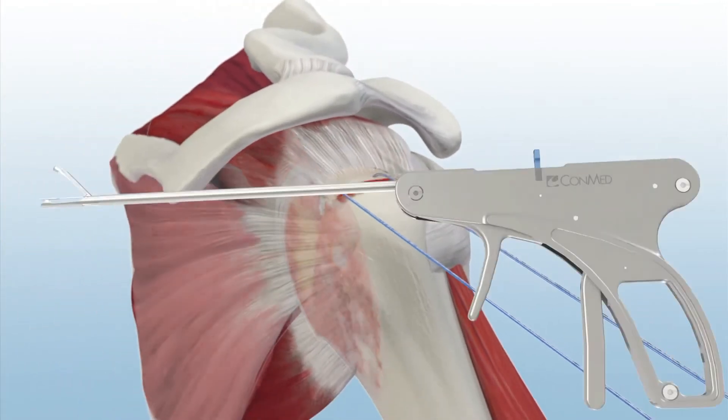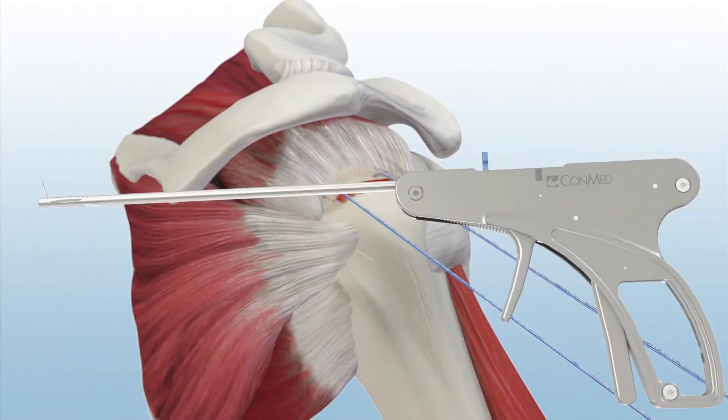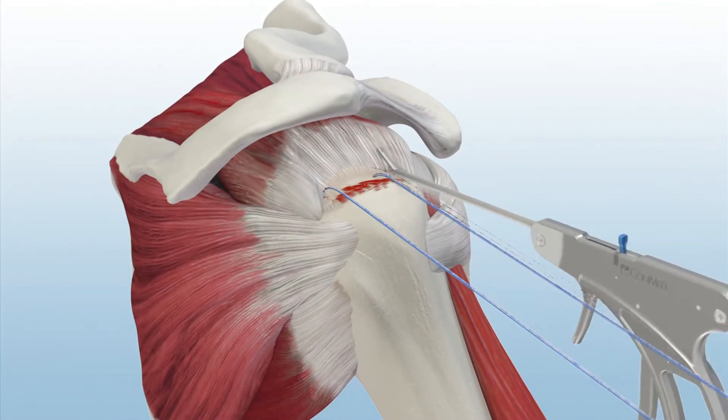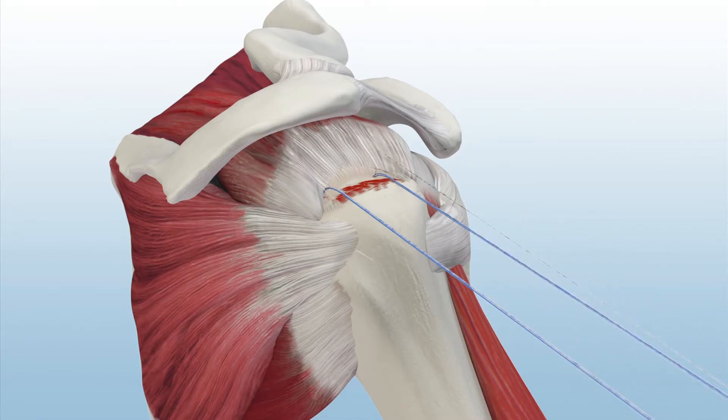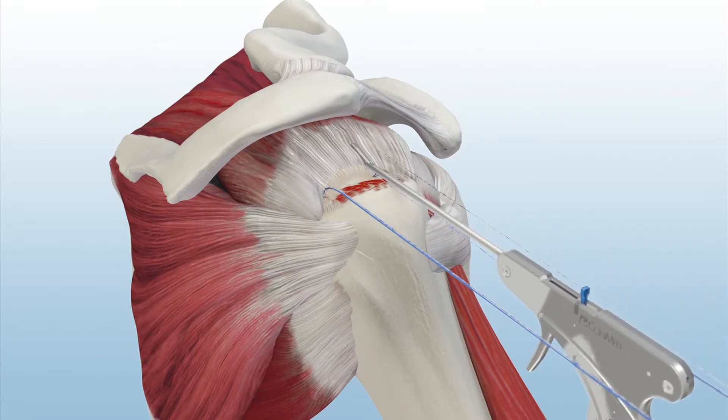The Spectrum AutoPass Suture Passer reliably passes suture in thick tissue and gives the surgeon the option of capturing the suture in the trap door or releasing the suture in the joint.